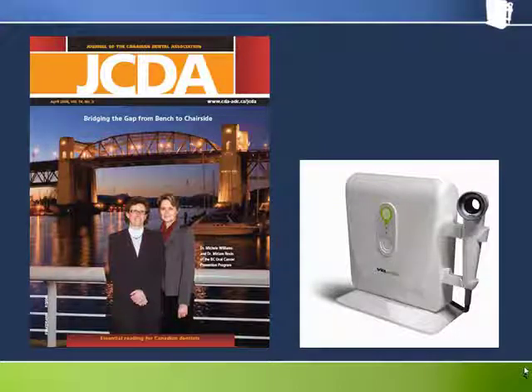When the scientists and clinicians at the BC Cancer Agency turned their attention to using fluorescence in the oral cavity, early promising results led to a partnership with LED Dental to develop and then later commercialize what came to be known as the VELscope system.